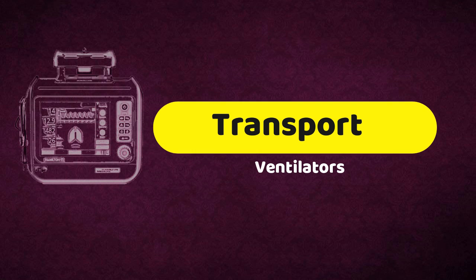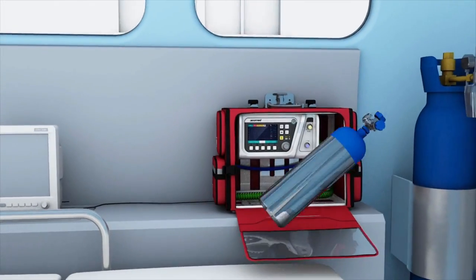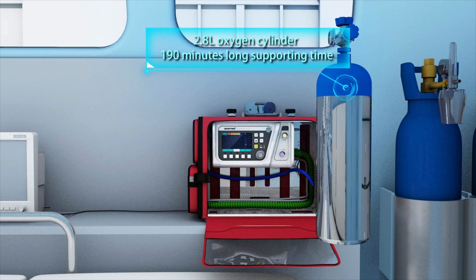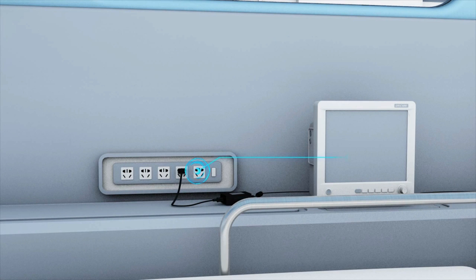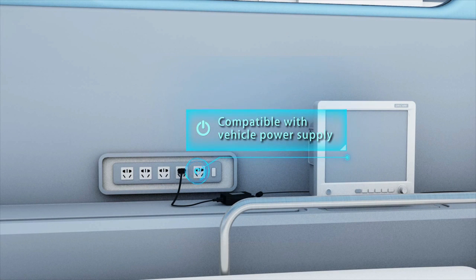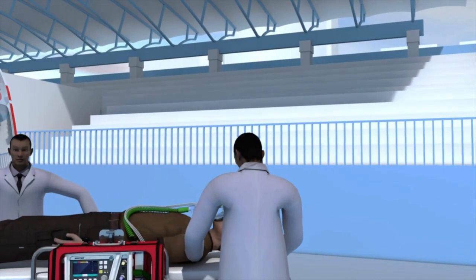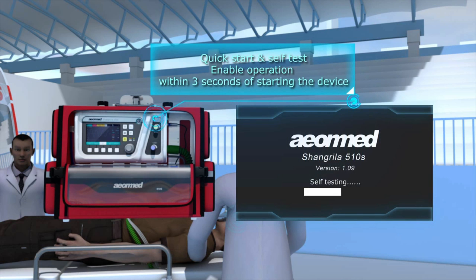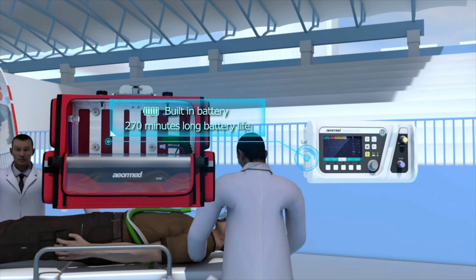Transport ventilators provide ventilatory support for patients who cannot breathe on their own or who require assistance maintaining adequate ventilation because of illness, trauma, congenital defects, or the effects of drugs like anesthetics. Transport ventilators are designed to take the place of manual ventilation or bagging during emergency or transport situations, including inter-hospital, intra-hospital, or pre-hospital emergency transport.